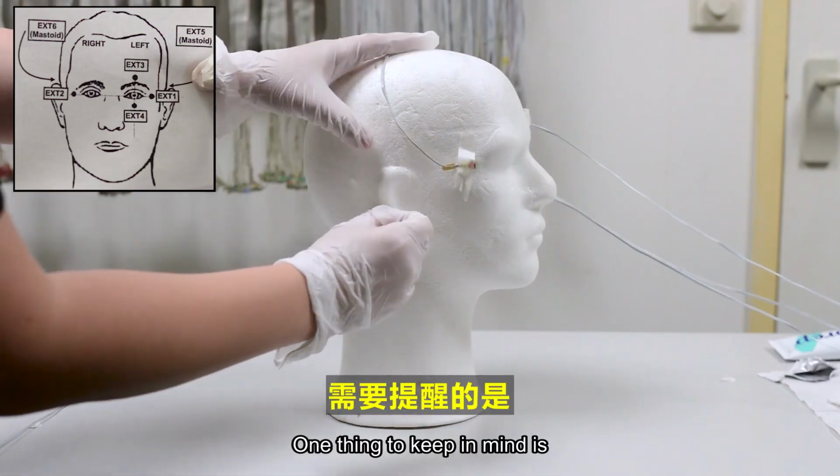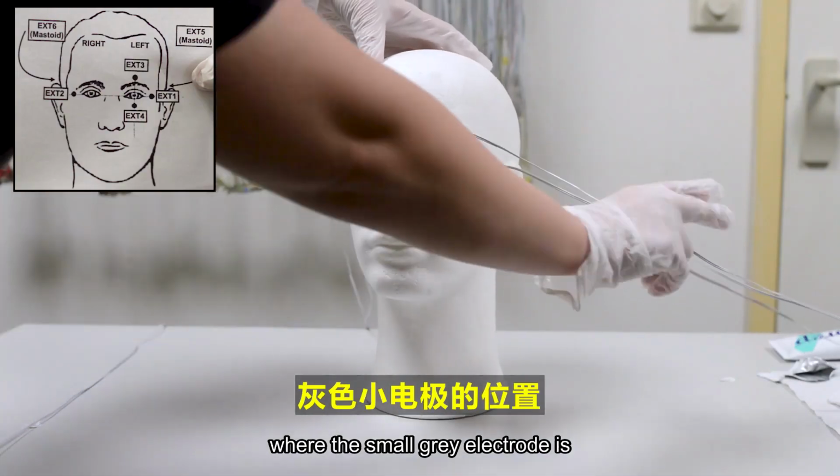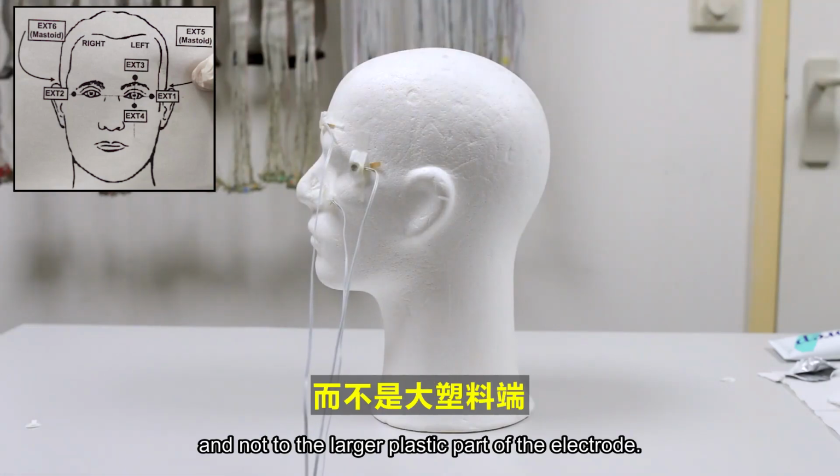One thing to keep in mind is that when placing external electrodes, you must align them according to where the small gray electrode is. That is the one that you put the gel on, and not to the larger plastic part of the electrode.